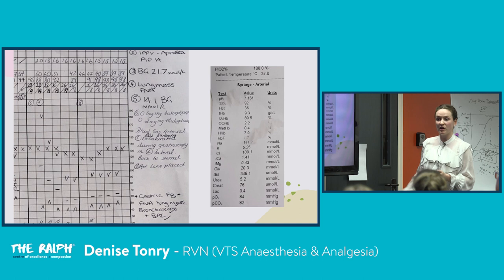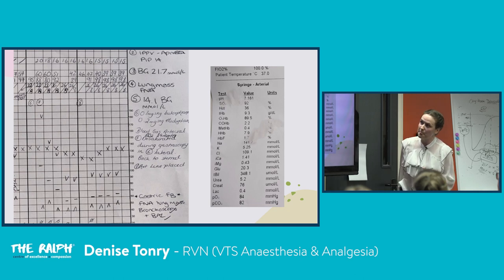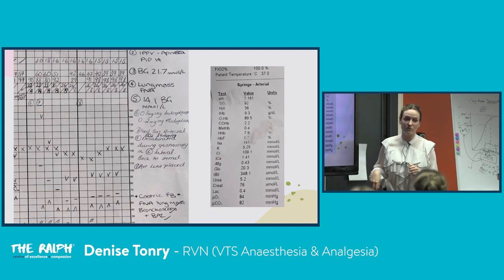But we completely decompensated this patient, just because of the procedures we needed to perform, but equally the pathology that she was already having. So it's quite interesting when it really starts happening. We did consider aborting the GA and stopping the gastroscopy, but again, it was an older patient, she was already under anaesthetic, and she had the foreign body, so we wanted to try and achieve getting it out. And at this stage, we were starting to get back to normal values with the SpO2.